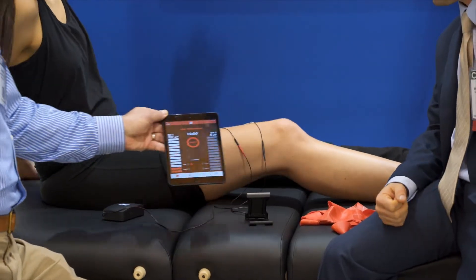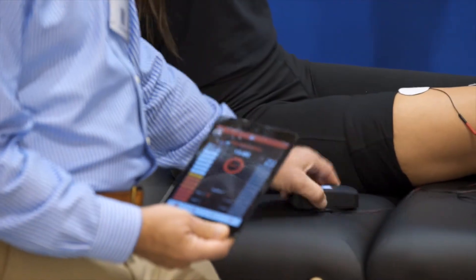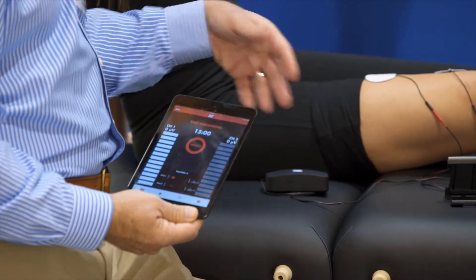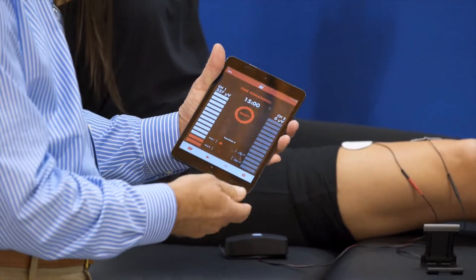It's a really simple product. This is on an app — you can download it on your phone and this will connect with any phone. So you can have one in your clinic that you can use on any patient that comes in. They just connect this via Bluetooth to your phone or your app and you can adjust this threshold of sensitivity.